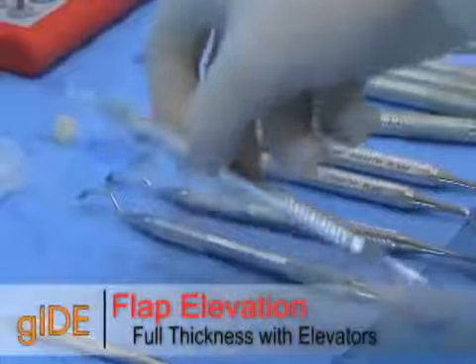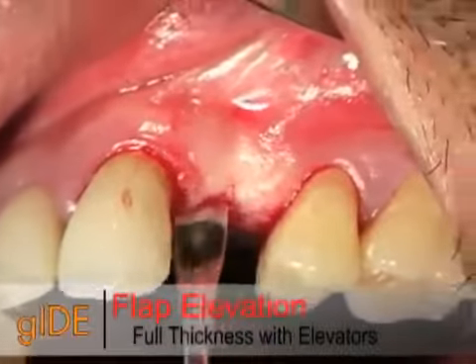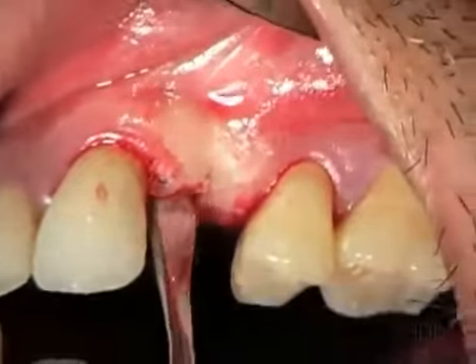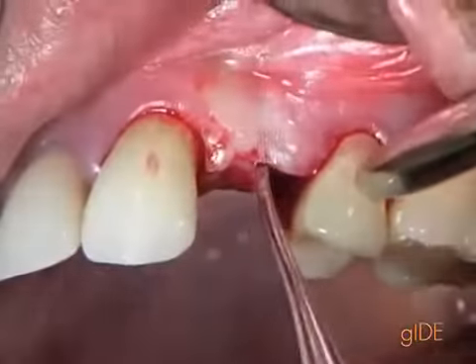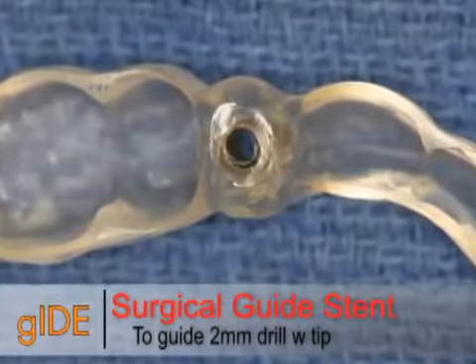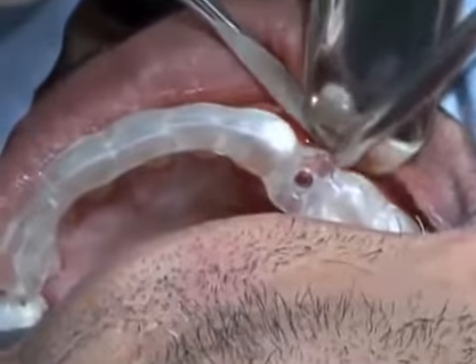Then elevators are utilized to make a full thickness flap elevation, which will show the underlying crestal bone. A surgical guide stent is used, which has an opening for a 2 millimeter drill with the optimal prosthetic position.